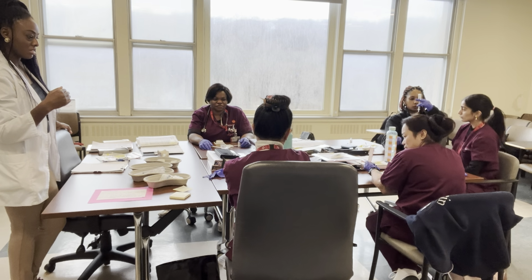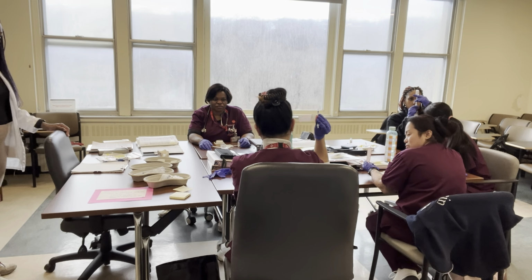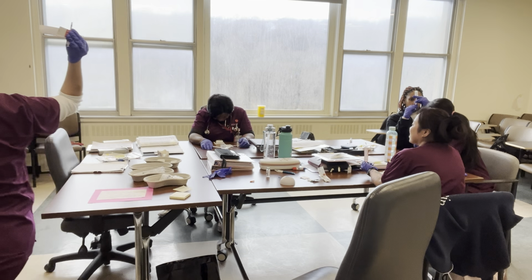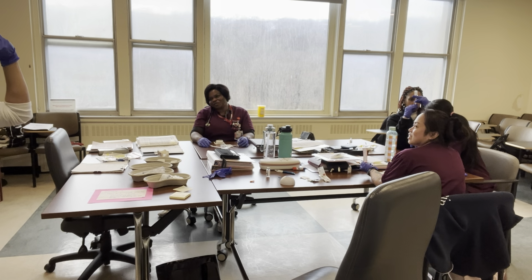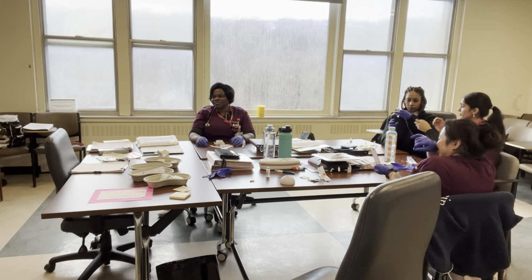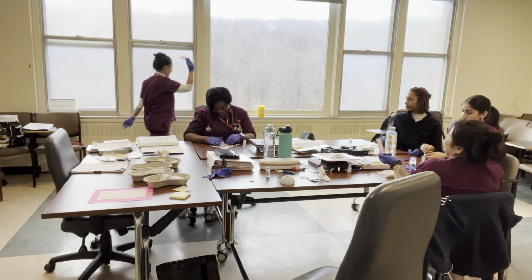And then I'm gonna count 5 seconds. Okay? And then I'm gonna repeat it. You have it up in the air. What do you say? I'll come back for you. No, needle. I'm right here. Needle. You have a needle in your hand. You need me to be aware of it. Keep walking. Sorry, the thing is, I'm walking here.